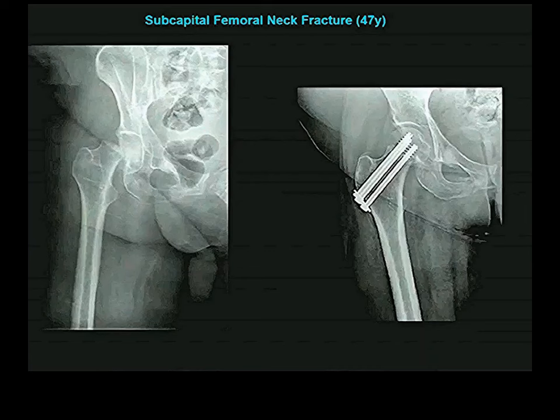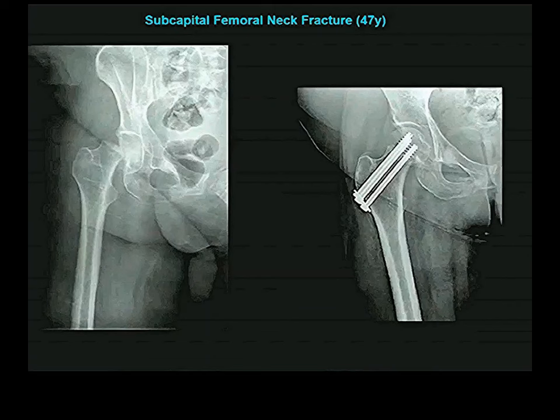Here is a person with a subcapital fracture, and here is how it is treated — internal fixation. They drill holes through the shaft of the femur and up through the neck to screw the head back in place. This is the method of choice if the person is not too old and has normal bone density. If they are very old or have osteopenia or osteoporosis, internal fixation will not be attempted.